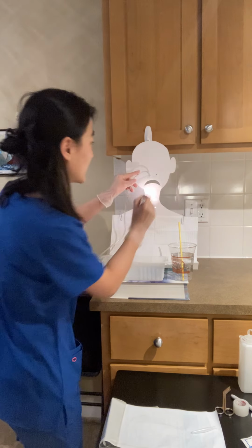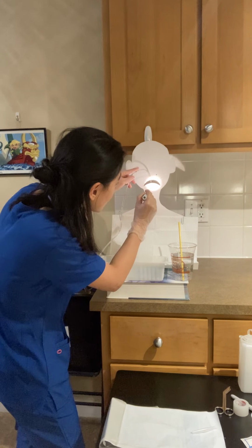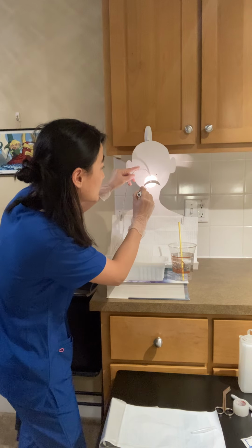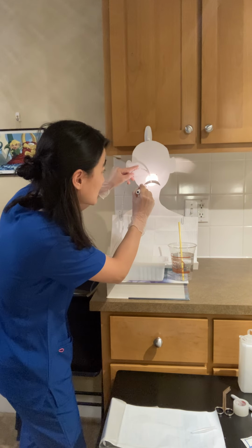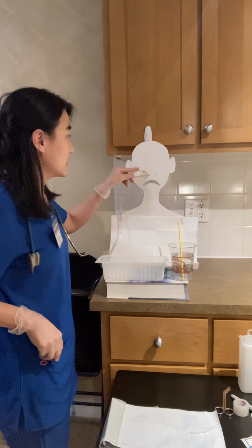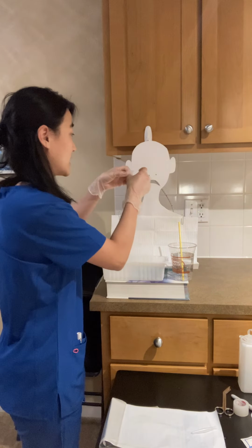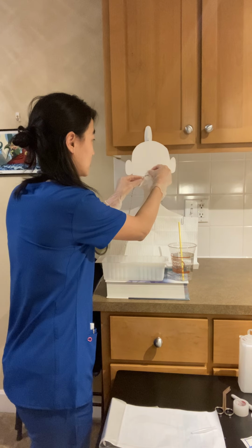All right. And now that the nasogastric tube is in to the point that was marked by the tape earlier, I'm going to take my pen light and, can I get you to open your mouth, please? I'm going to look at the back of his throat and make sure that the nasogastric tube is in place, that it is nice and taut, and that it is not kinked or curled up in the mouth. And then I'm going to take my piece of tape and anchor the nasogastric tube to the bridge of his nose.